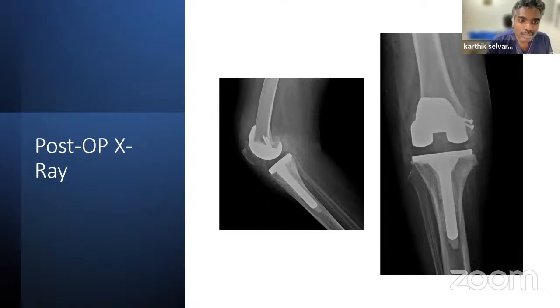That's because we had to compensate for the lateral laxity, and we left the patient in about 1 or 2 degrees of lateral laxity here, and we added the stem, but I haven't put a graft. I did a little bit of reduction osteotomy on the tibia. There is no defect, but I just added a stem just in case, because this bone was porotic as well. So this patient has done well, still walking with a cane.